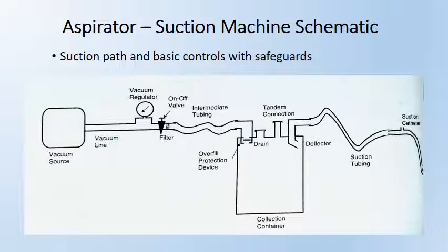The other things that are necessary to service are making sure there are inline hydrophobic filters that prevent any of the fluids from the patient from entering the vacuum source, entering the regulator, or entering the compressor, because this can clog valves and is most frequently the reason that an aspirator will stop working or not perform at full vacuum.